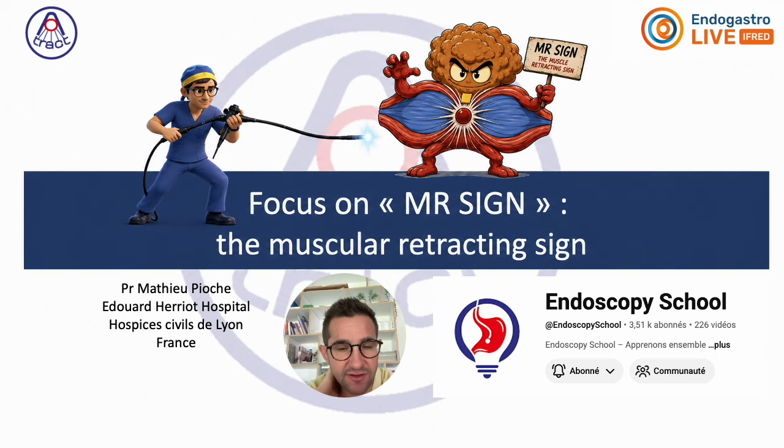It appears that this is a very difficult situation in ESD, in particular lesions, and therefore it was a very good opportunity to do an episode exclusively on this.